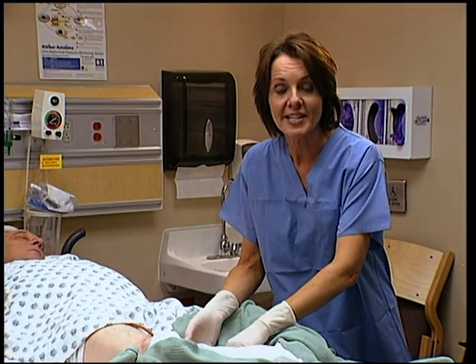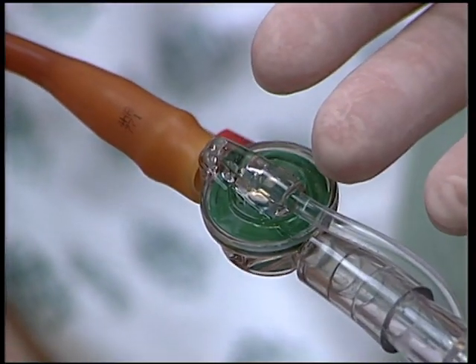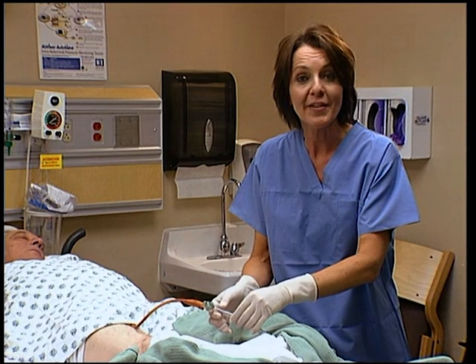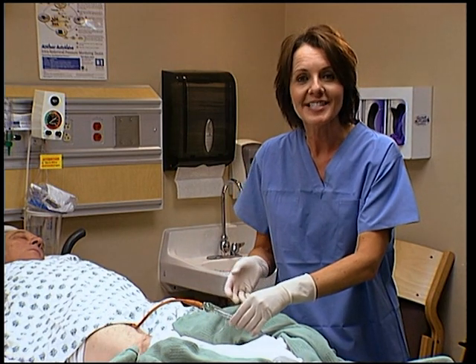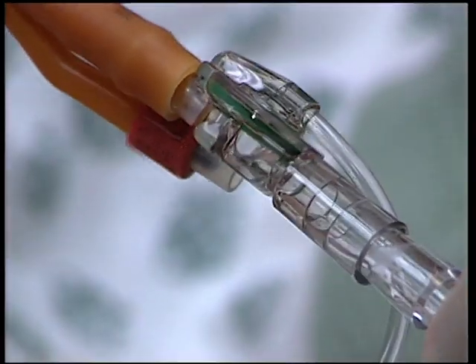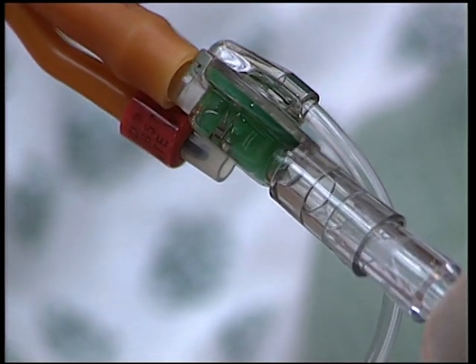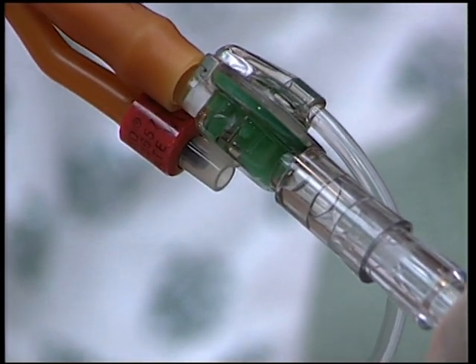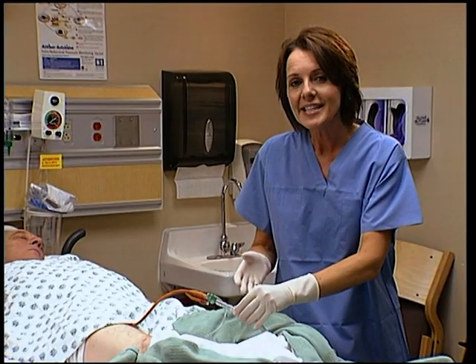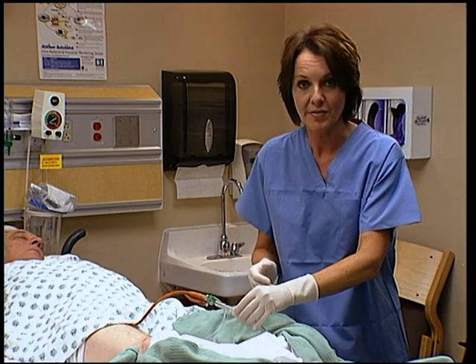The heart of the AbVisor is a unique valve that connects directly between the urinary catheter and the drain tube. Once attached, the system never needs to be opened again, maintaining a sterile urinary drain system. When fluid is injected into the system, the diaphragm within the valve is automatically inflated, occluding the drain and directing fluid into the bladder. In this inflated position, you are able to accurately measure intra-abdominal pressure.